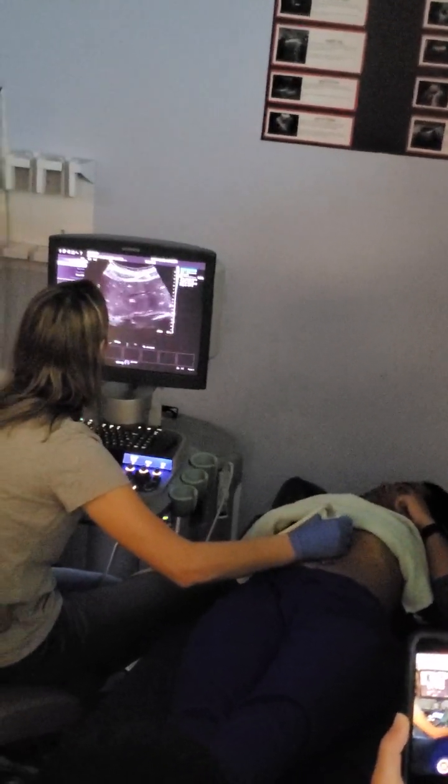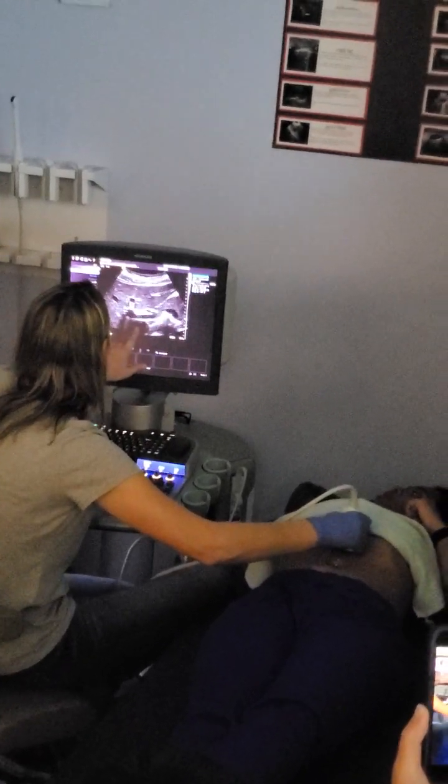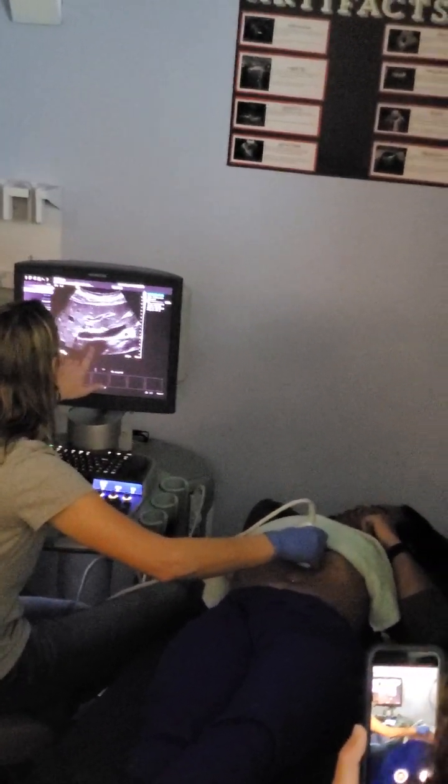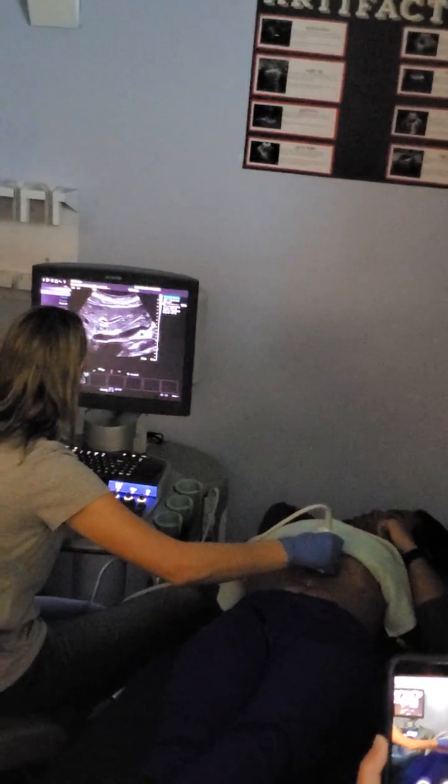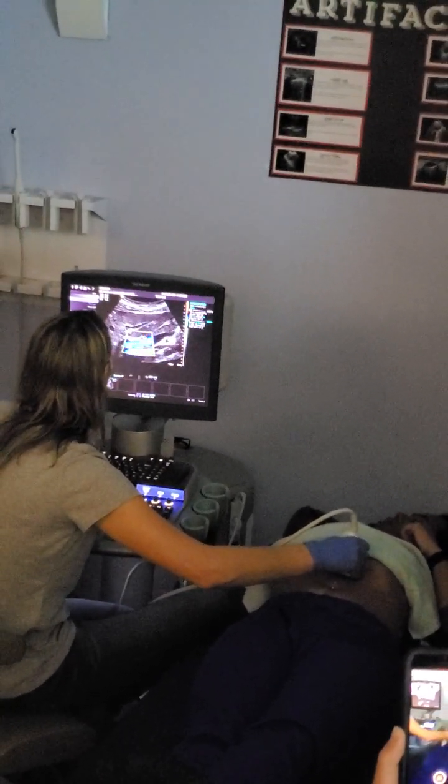Alright, so we're going to start. We're kind of at dome land, coming into hepatic land, kind of cruising down. Here's our IVC, and we're waiting to see that main portal vein open up along that IVC, kind of turning to 10 o'clock. I'm going to put my color on to prove that that's actually common bile duct.